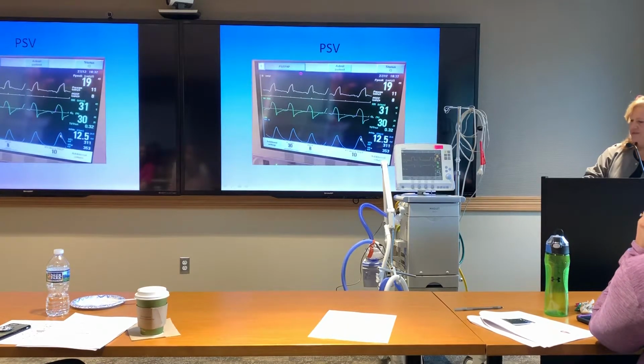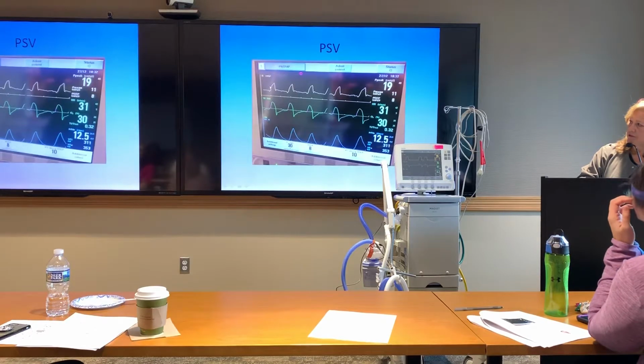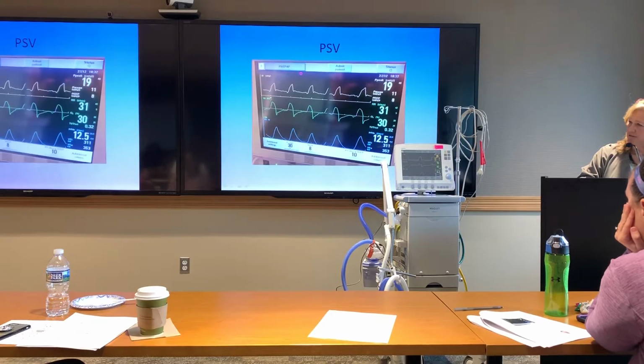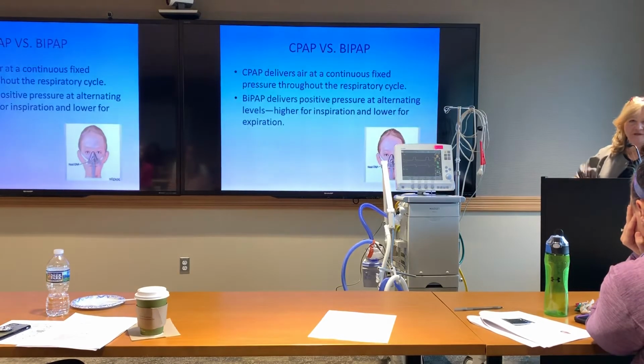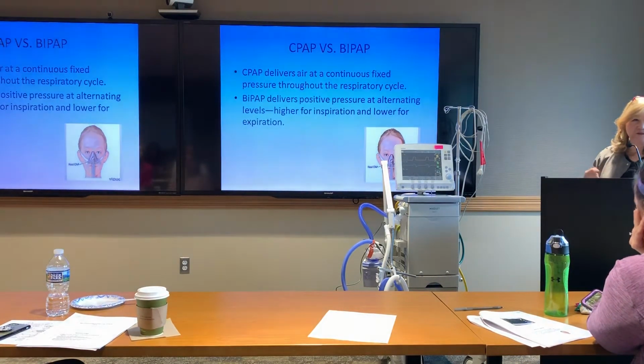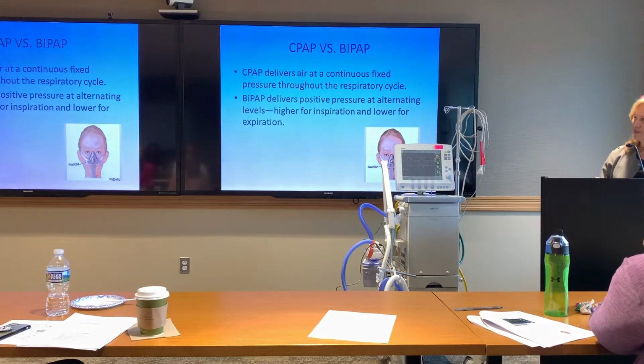That's probably enough. You guys know, right? The little pink trigger means the patient's triggering the breath. The little pink line here means that's what the patient is doing. I call it pink. Some people say it's red, I don't know. If it's here in the flow, then that's the trigger. If we're not flow triggering, which we generally do, you might see it up here in the pressure triggering, but that makes it a little harder for the patient to take a breath. Probably not as likely in your unit. We need to switch that over if they have a BP fistula or a chest tube leak, where the chest tube is still bubbling, causes that flow that goes out and tends to trigger the vent artificially.